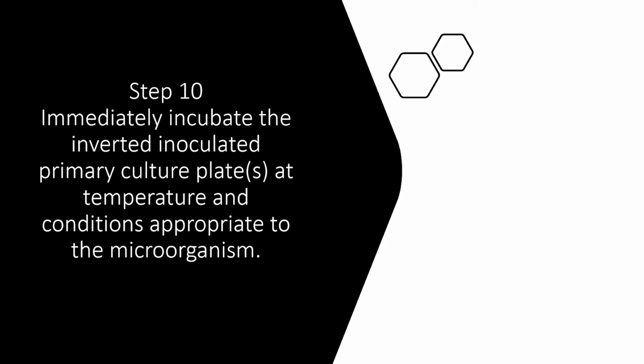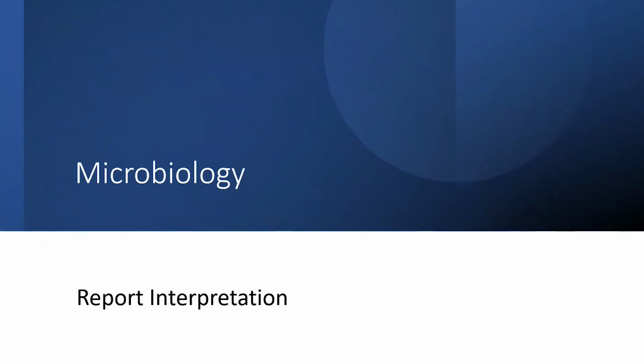That's where the kit insert comes in, because it gives the labs the information they need to know what temperature and conditions would be suitable for that microorganism. So that's getting the sample and plating it out, and what you're going to do now is report the results back to us, which is done via RIQAS as normal.